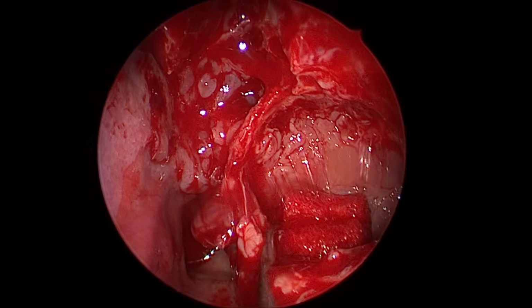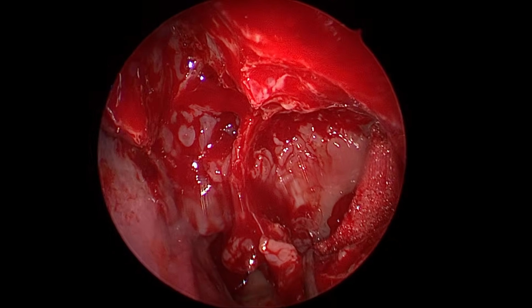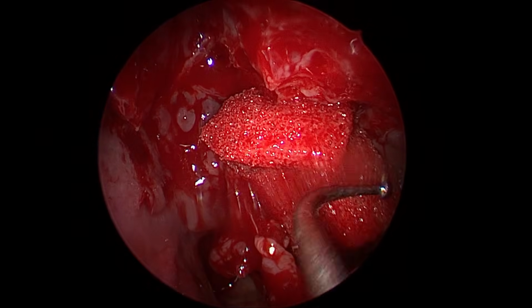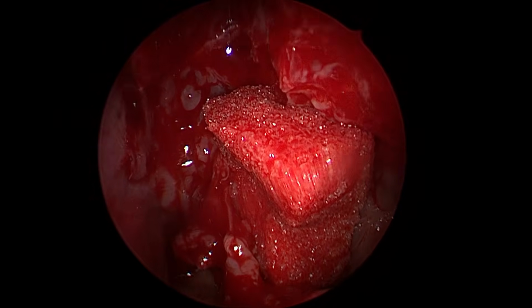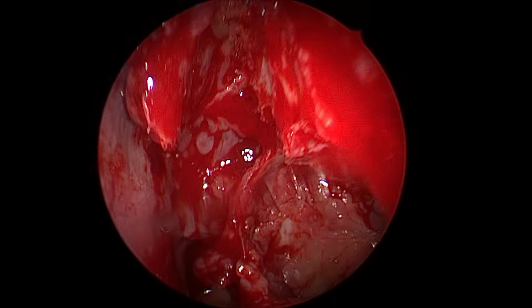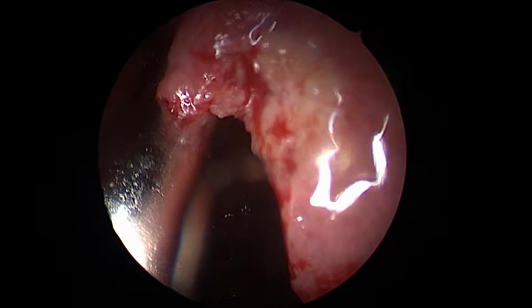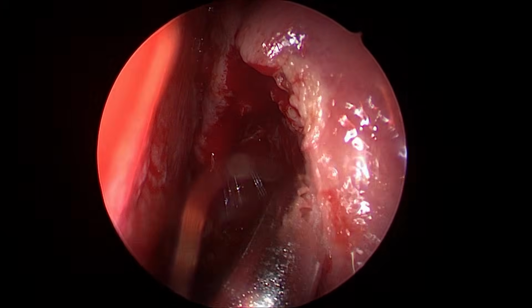See now, all the middle meatal, the maxillary sinus mucosa is good, healthy now. Little edematous because of the lack of ventilation drainage, but now see the mucosa. We have protected the mucosa to function, to allow it to recover, not remove the mucosa. Never ever.